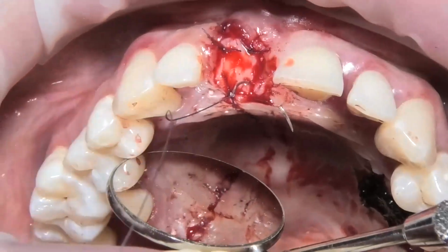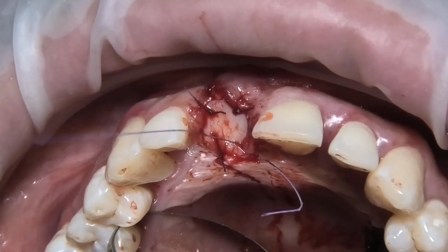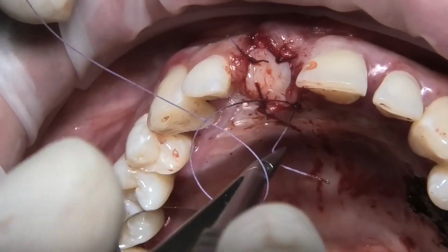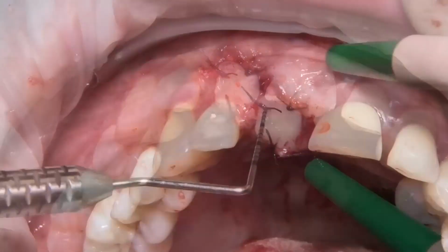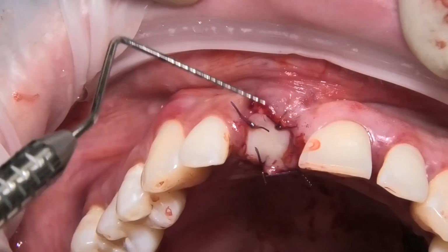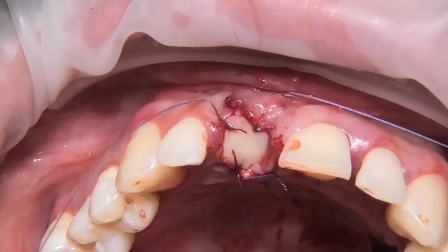It's important to use very thin suture, 5-0, 6-0, sometimes 7-0, resorbable. Now, usually we use polyglycolic acid suture. After this, we can perform a final suture to crush the vestibular flap in the palatal direction and against the graft by performing an external horizontal crossed mattress. We can do the first one, and after this the second one.